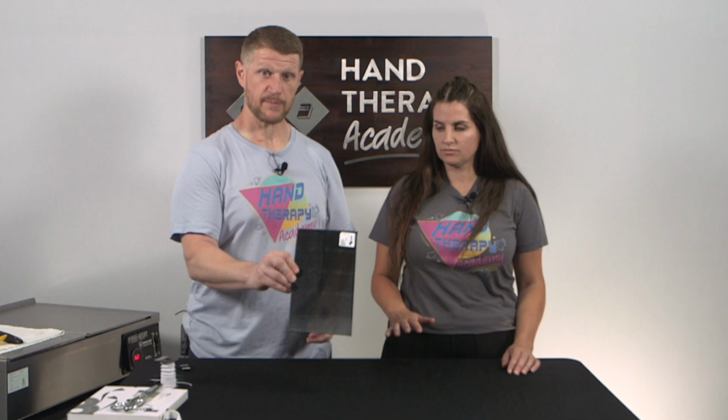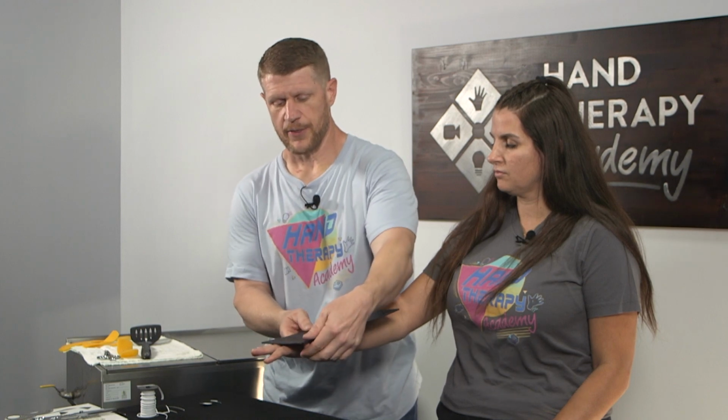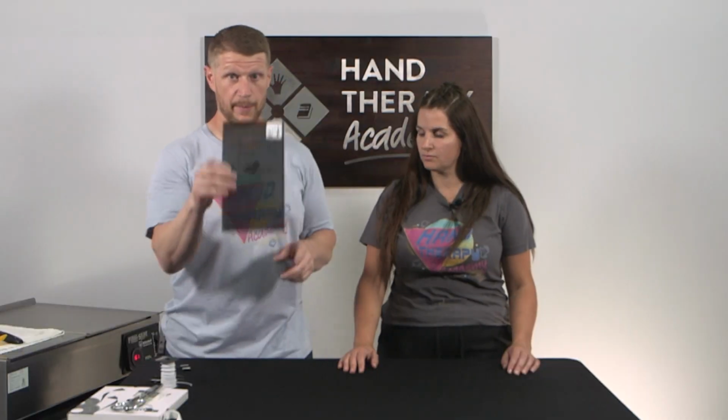So this is the piece of material we're going to make. Give you a frame of reference for Miranda. It's going to go from the PIPs, we'll trim it obviously, thumb as well, and about 2/3 the length of the forearm. Okay, so that's all the more I need. I'm going to drop that in.